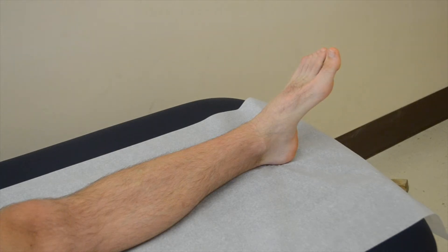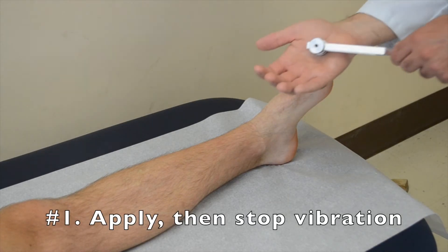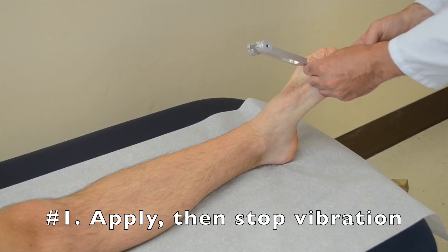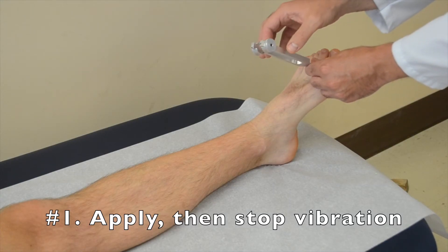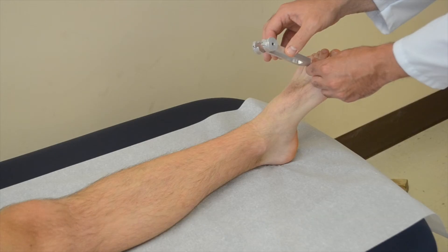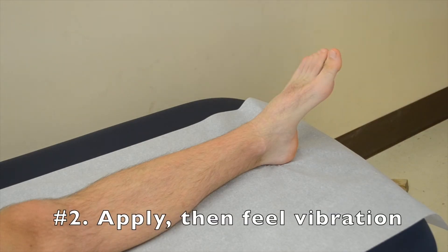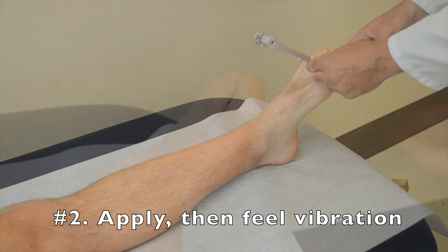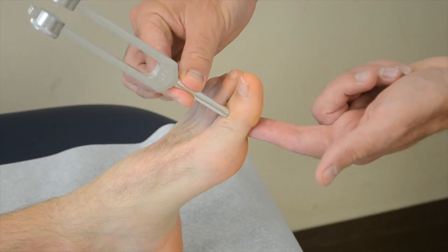There are two techniques. Number one: apply the vibration and then ask the patient if they can sense when it's stopped as you hold on to the tuning fork. The second is to apply the vibratory sensation and feel on the opposite side of the joint for when the vibration is present and when it naturally fades away.